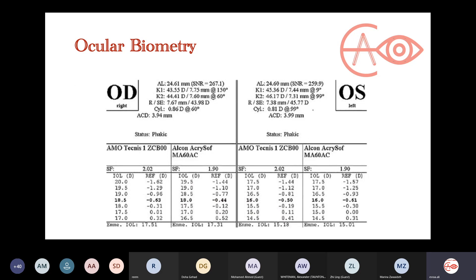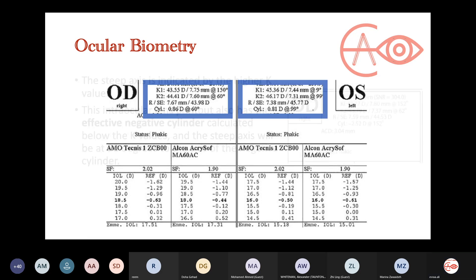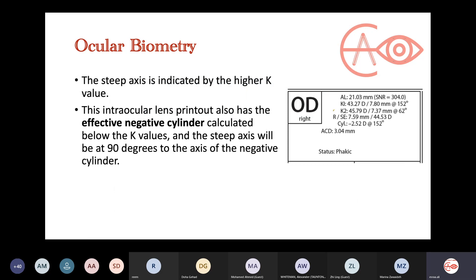Going back to the printout, what you need to look at — especially in the exam — is this box showing the axial length, and measurements related to the cornea. You have K1 and K2, which are the two meridians of the cornea — the corneal power readings. The steep axis is indicated by the higher K value. So if they ask what is the steep axis, you pick the higher number, which is K2, at 62 degrees.